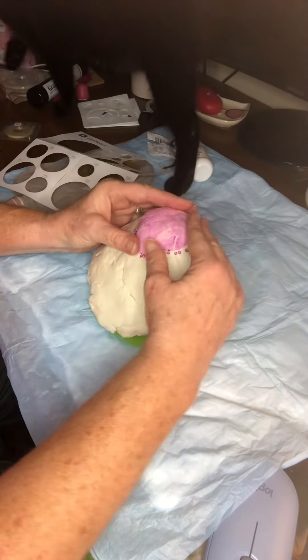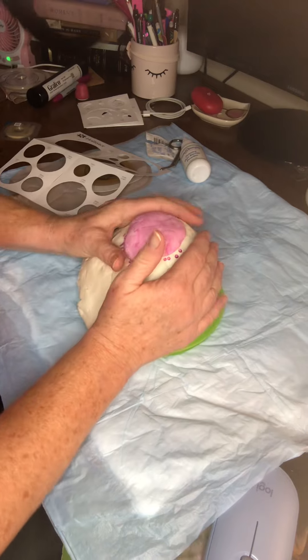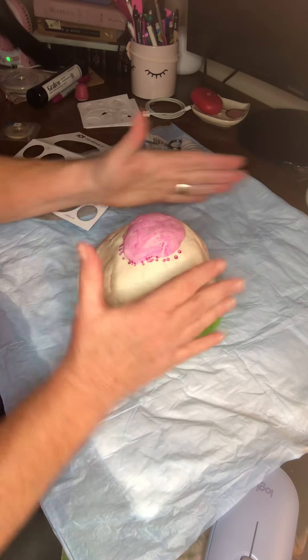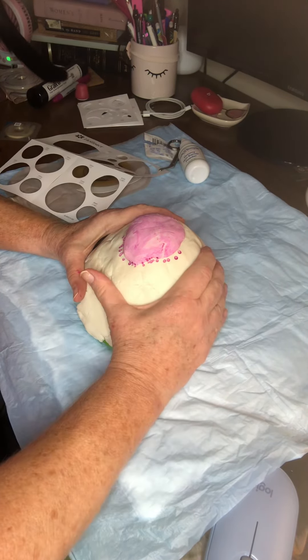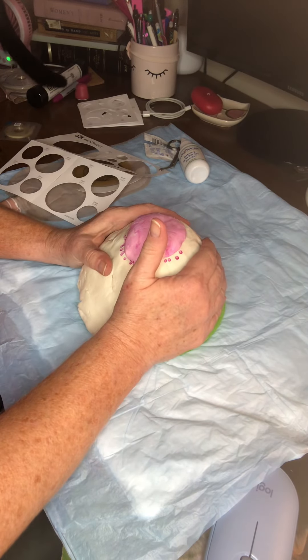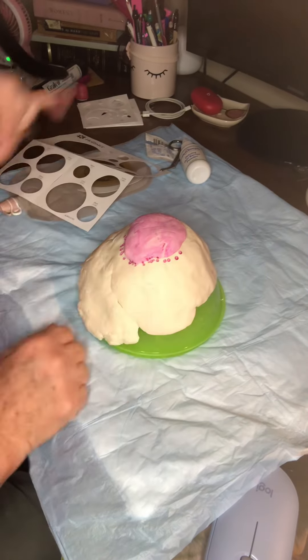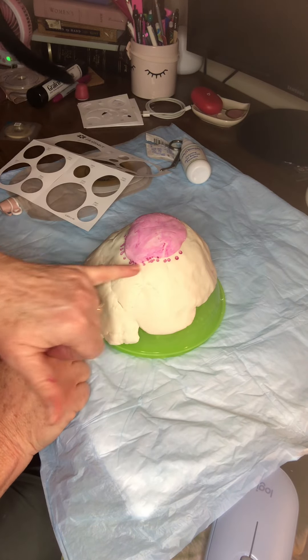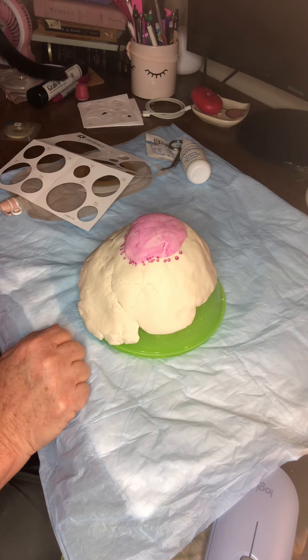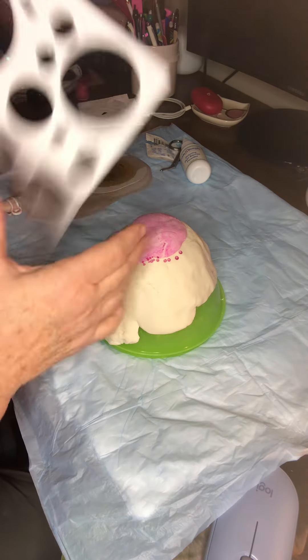Here is a parastomal hernia and how to pouch it. If your hernia is firm, you're going to want to go with a flat flexible pouch. Here is hypergranulated tissue or possibly just irritated skin — I'll show you how to treat that as well.